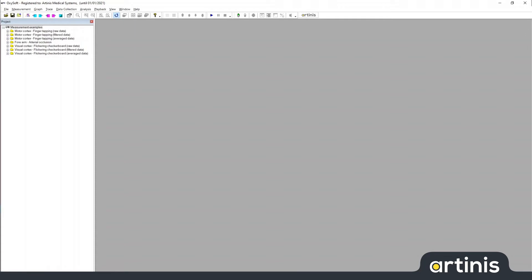Hi, my name is Christopher from Artinis Medical Systems. In this video I will give you an overview of the OxiSoft user interface.